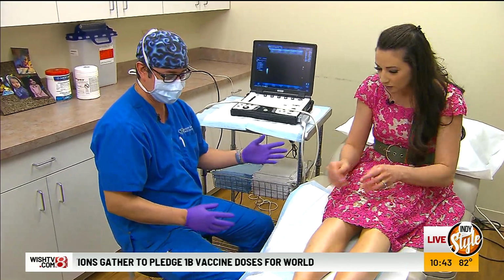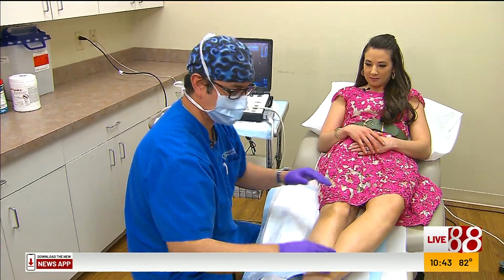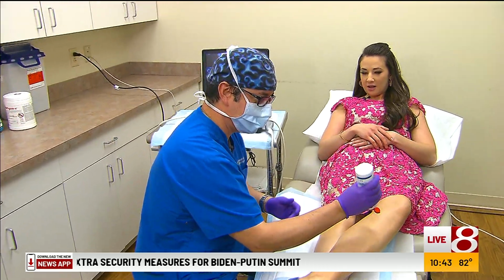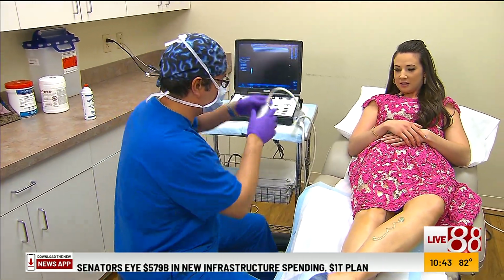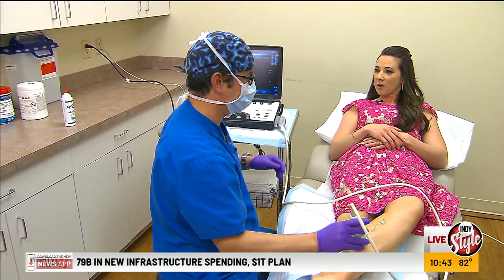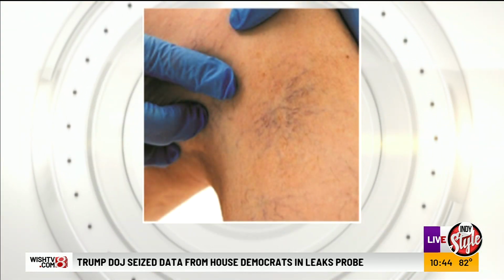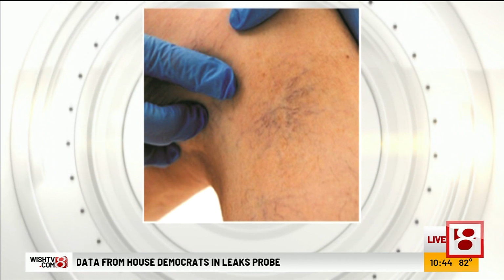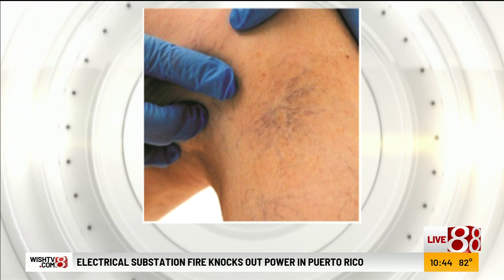Well, I'll just have you lay back a little bit here, and we'll just look at the leg portion here. Okay. You can turn it out just like that. There you go. We need some gel so I can see. Oh, so it allows you to see even further. Yes. Interesting. And we've talked in other segments, doctor, while you're doing that, the big question is, why do I have these veins? Where do they come from? Well, it's multifactorial. Genetics we know is a factor. Getting older, pregnancies, stand-up jobs, all those influence whether or not you get vein disease.